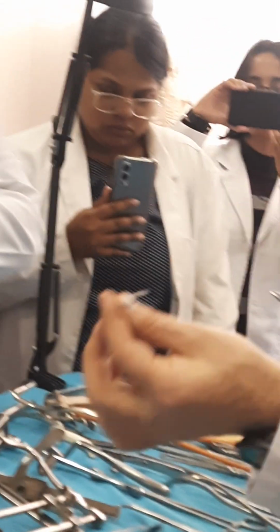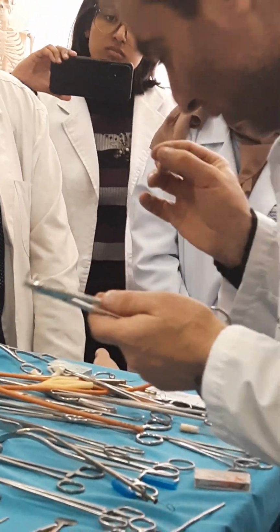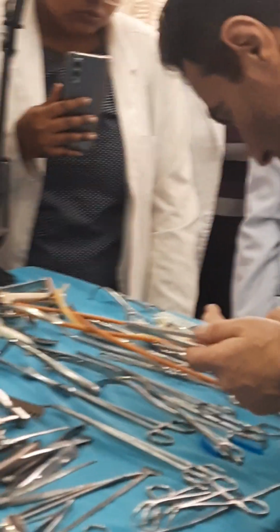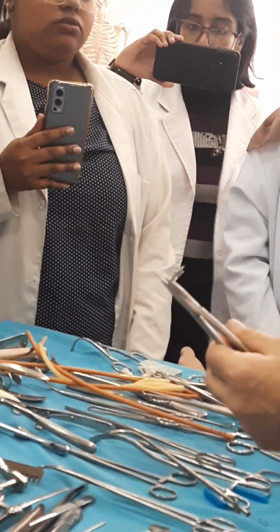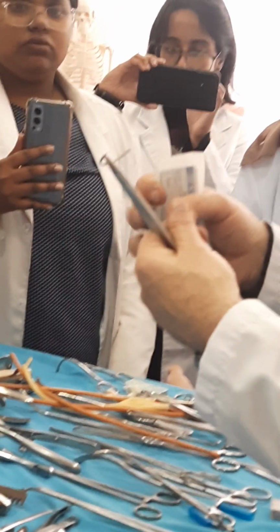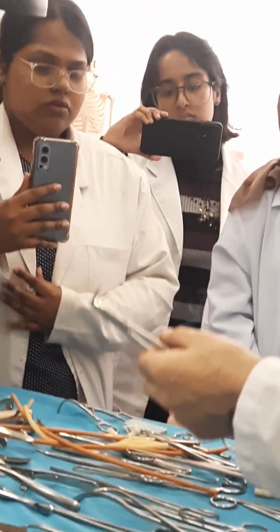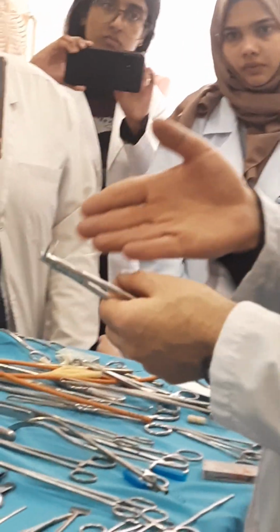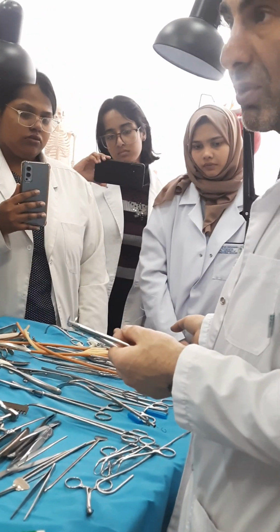Now look at me. Needles. Classified by different characteristics. First of all, the kind of needles into which you need to insert the thread is called traumatical. The kind of needles located in sterile pockets, connected with the thread in factory condition, is called atraumatical. Of course, the first can be used many times, you can sterilize it and use it as you need. The other is single-time use.